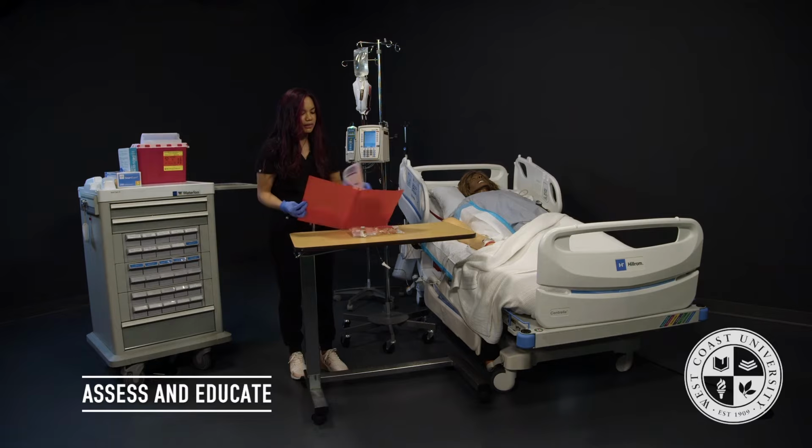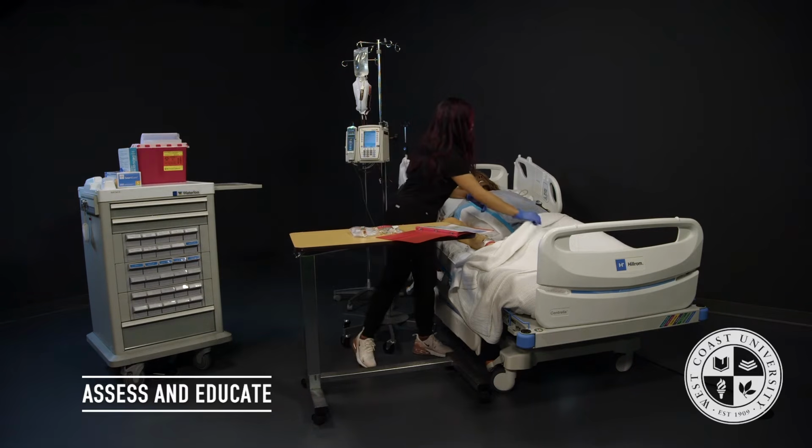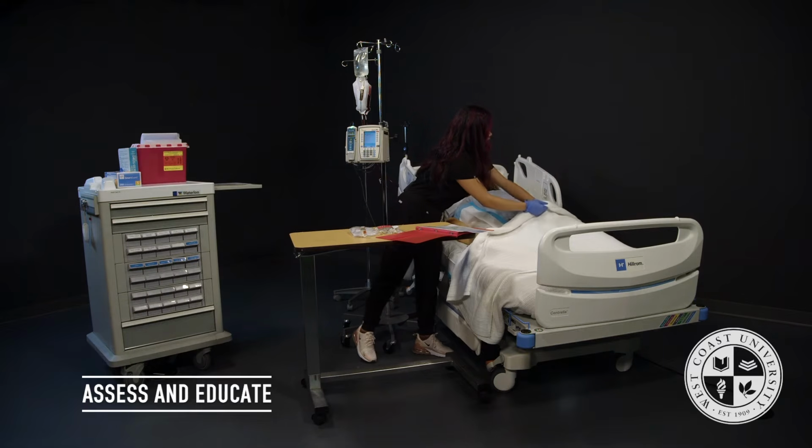At this time, I'm going to go ahead and assess your skin, Mrs. Cruz. So I'm going to go ahead and lower your blanket a little bit. I'm going to lift up your gown. I'm going to be giving your medication into your abdomen, so I'm just making sure you're free of any bruising, redness, wounds, or any bleeding at the site.